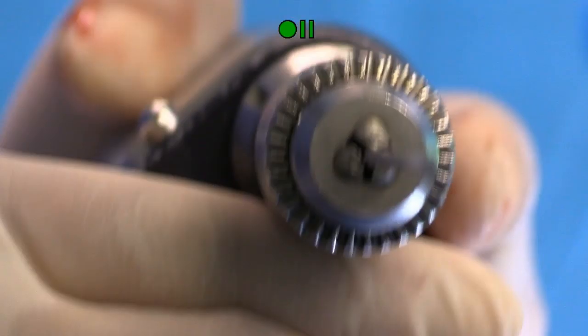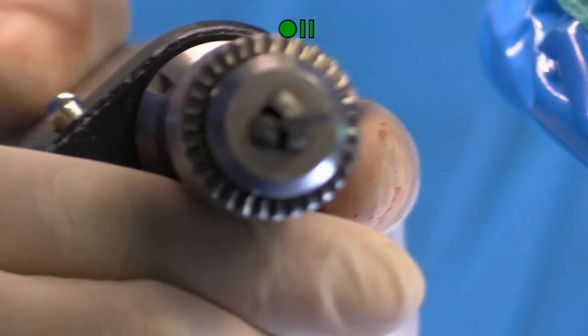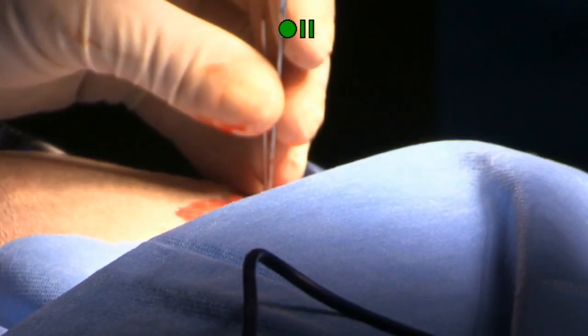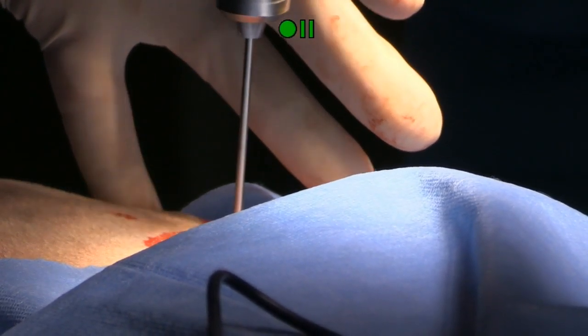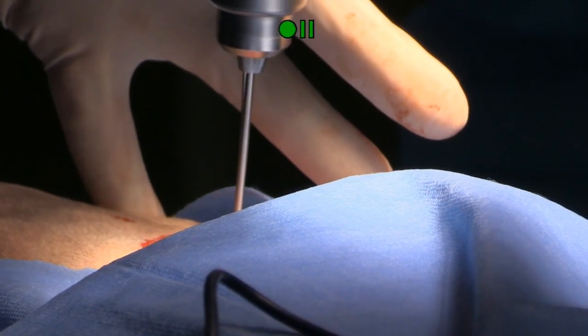So we're trying to show you that there's a hole going right down the middle of the drill bit, but I don't know that we're going to have a lot of luck there. Anyway. So the drill is going to run over the top of this pin. So you're using that pin as a guide. The drill bit goes right over the top of that. So you're drilling a glide hole first.